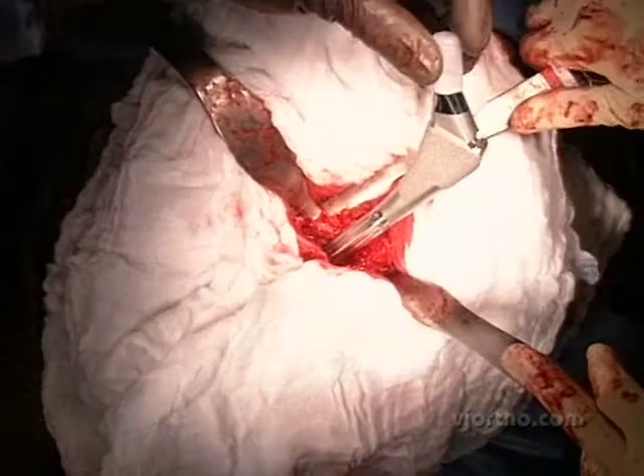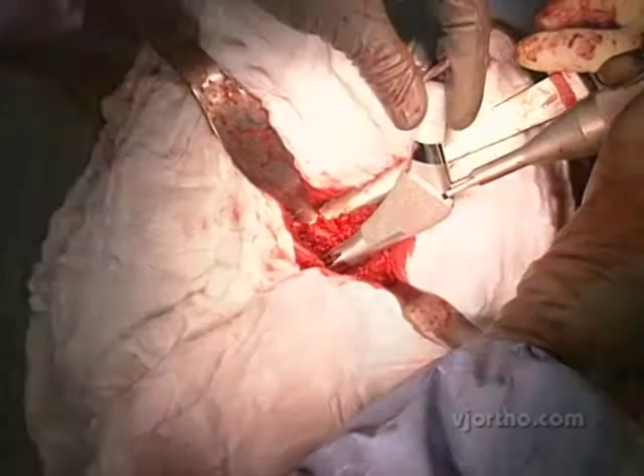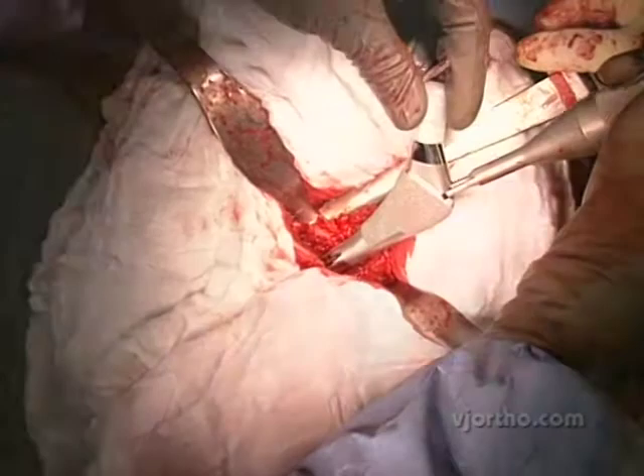Overall, combining low wear bearings such as alumina ceramic bearings, decreasing the size of the incision, and improving the precision of the surgery with image guidance, I think I have a greater confidence that every single patient will have the right size implants in the right position, with the right tissue tension and leg length.